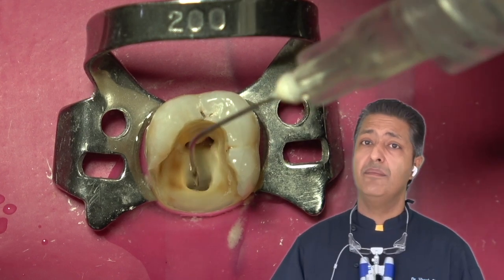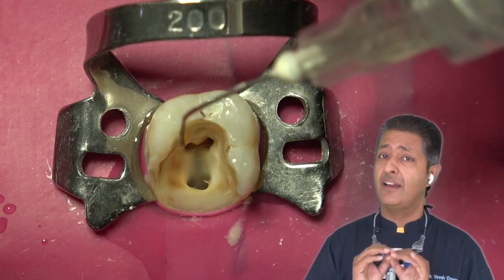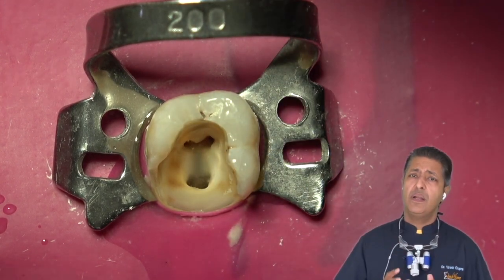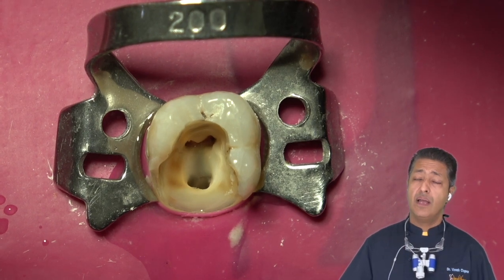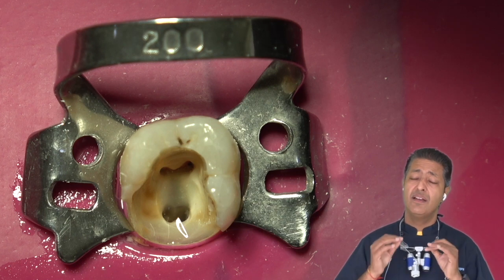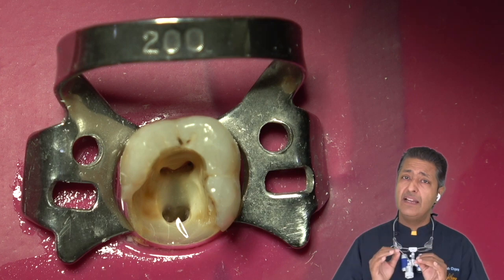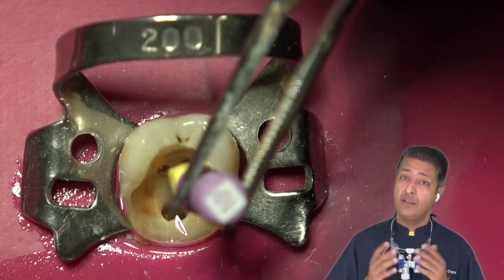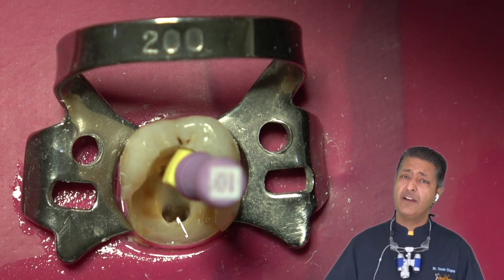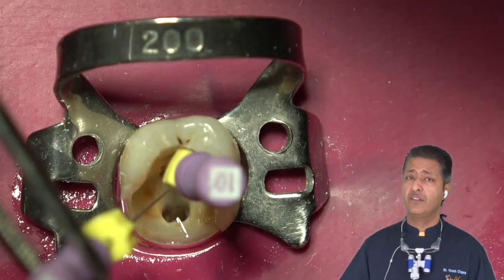Again and again I am emphasizing, because irrigation does magic. The irrigation dynamics does magic to the root canal system. Once adequate irrigation is performed and canals are absolutely clear, the time has come where we can introduce the first files inside the canal. Yes, the first file in general cases is the 10K file, which needs to be introduced inside the canal to check for canal patency.